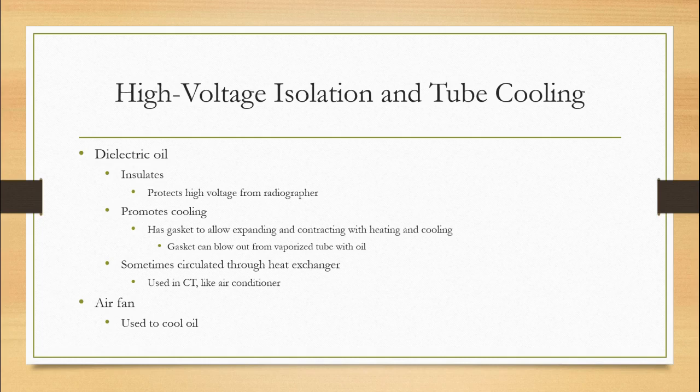I've had it to where the oil has dripped on patients and it's really hot. So you obviously need to move that tube away from the patient and get the patient away from it. I've never seen an explosion. I've never heard about an explosion, but I have had oil drip from the housing.